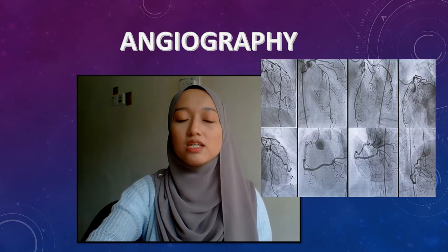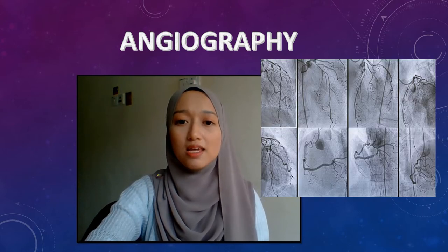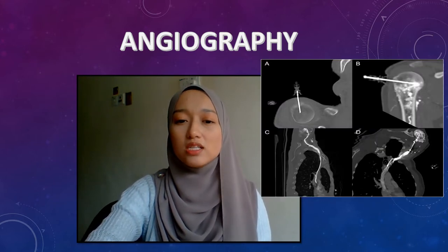Angiography is a procedure used to make pictures of blood vessels, including those of the head, kidneys, heart, arms, legs, or lungs. A contrast dye medium is injected into the artery so that the blood vessels can be seen. Angiography may be done to see how the blood flows through the blood vessels. It can help plan treatment, including embolization or chemoembolization.